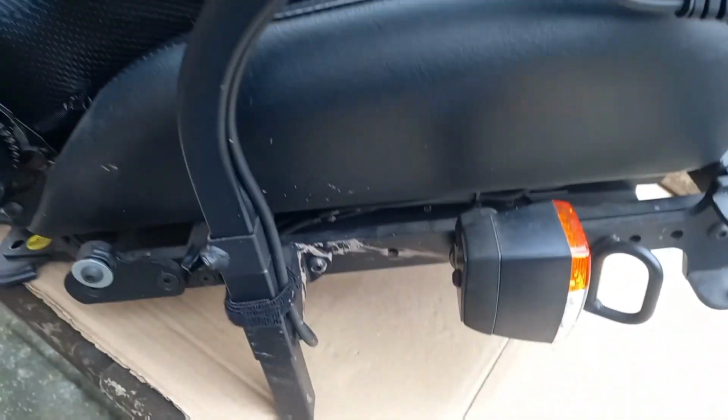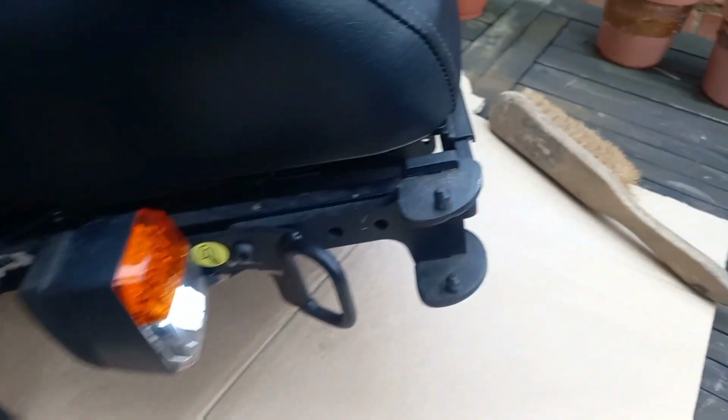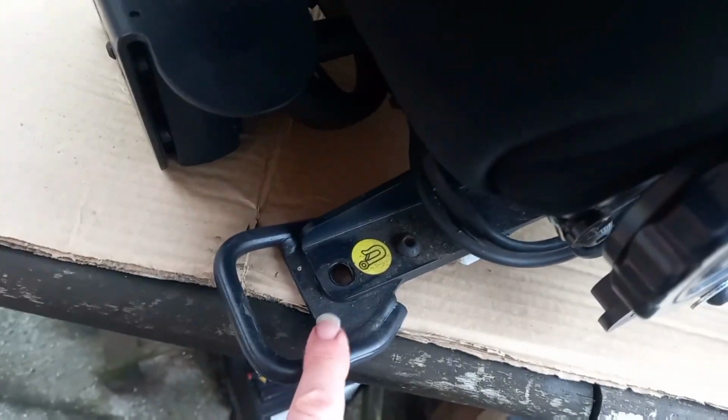So what's going to happen? You can take them out if you want. Well, yeah, that's another contract, though, isn't it? So they've got to. That's where the turrets sit, there and there.